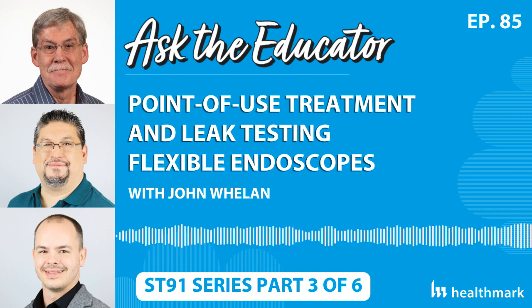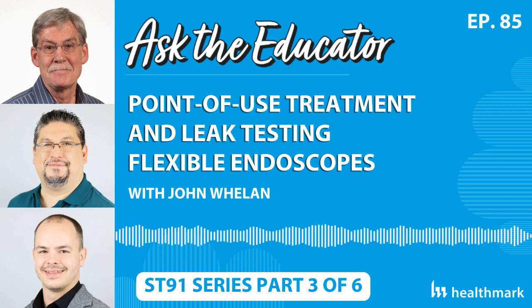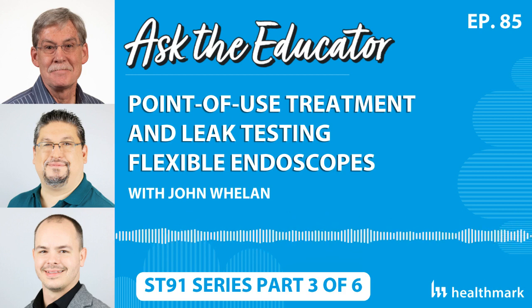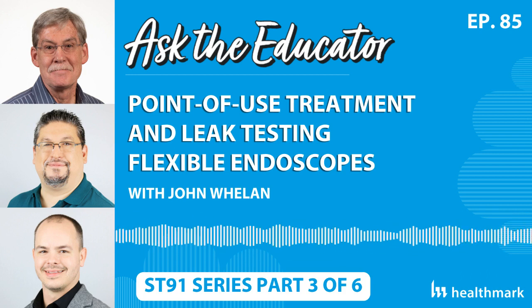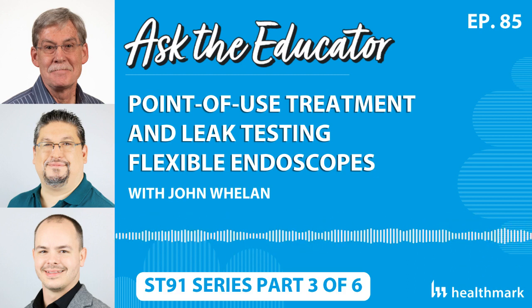Now, one size doesn't fit all. Even though I might have a particular favorite that I think is good, for one, not everybody can operationalize in the same way, meaning we had scopes routing to a central location from multiple sites. OR had the electronic software, SPD had the electronic software, but endo and all the clinics did not. So we made the standard practice be the patient sticker with the time on it.